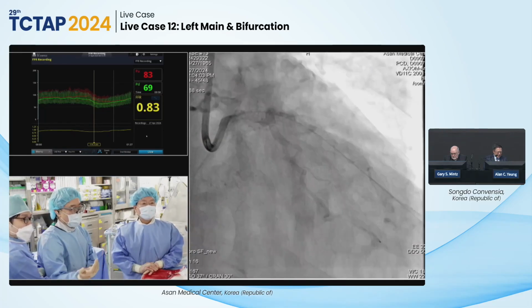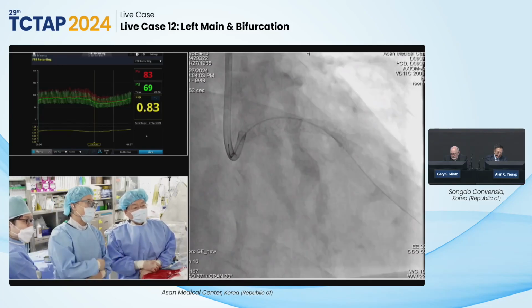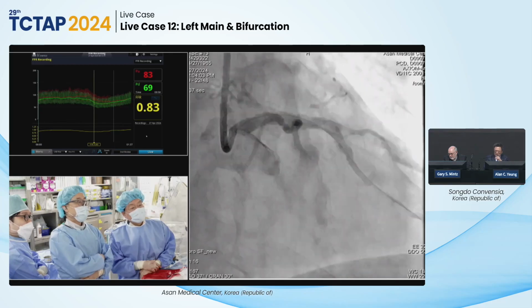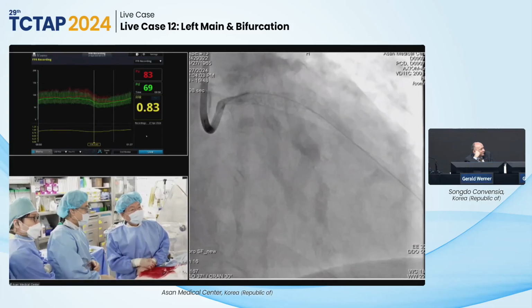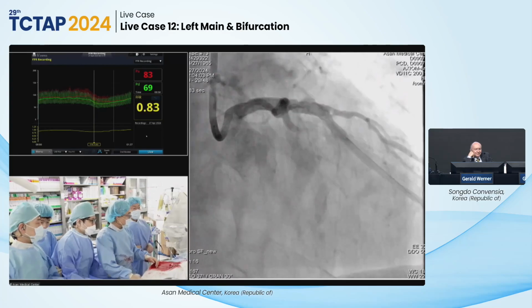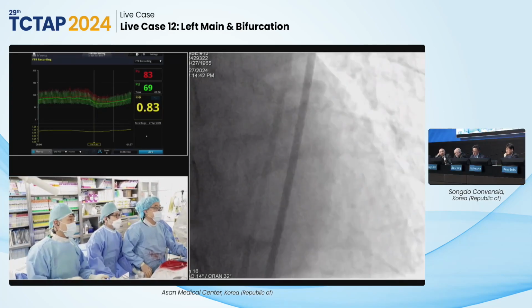I guess many panels have some complex ideas about treating the diagonal branch. Treat or not to treat the diagonal branch? If you measure FFR and it's significant, people say you need to treat it. Let's image the diagonal once more to make it clean. Okay, right now, for a clear decision, we're gonna show again the diagonal branch angiographic stenosis.